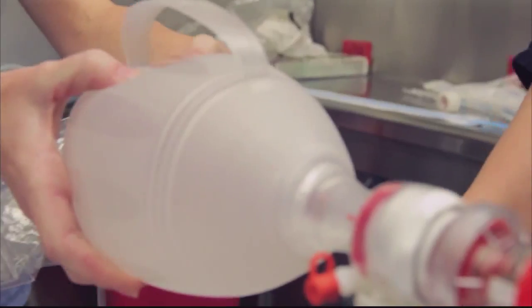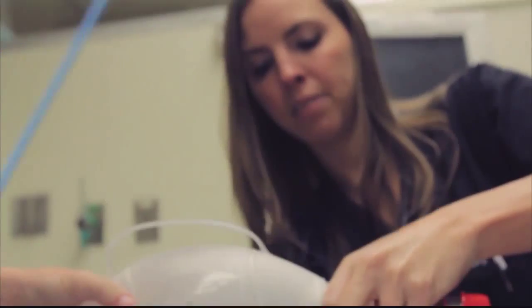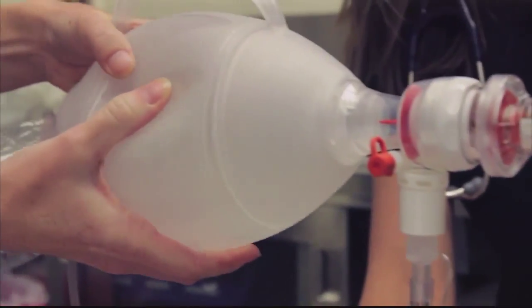Should I bag the whole volume or just half since we're only ventilating the left lung? We should do only half since we're only ventilating one lung. Good thought. Bagging perfectly now. All right, I'm gonna go ahead and call ENT. Doctor, I can't bag again and the sats are dropping. What's going on? There's no air going in. I can't bag at all. Okay, let me try. You're right. Okay, I think that the foreign body must be up against the tube. Grab me a bougie, stat. Okay, unhook the bag. There we go. Okay, connect it back up. Perfect. Ventilating now? Yeah. Definitely. Did you push the foreign body back down the right main stem with the bougie? That's exactly what I did.